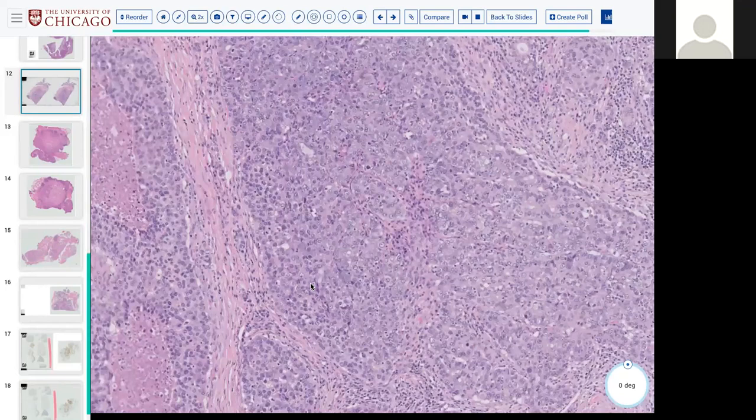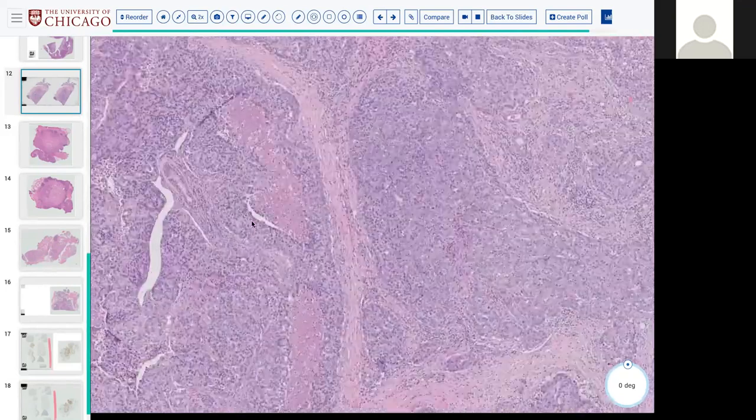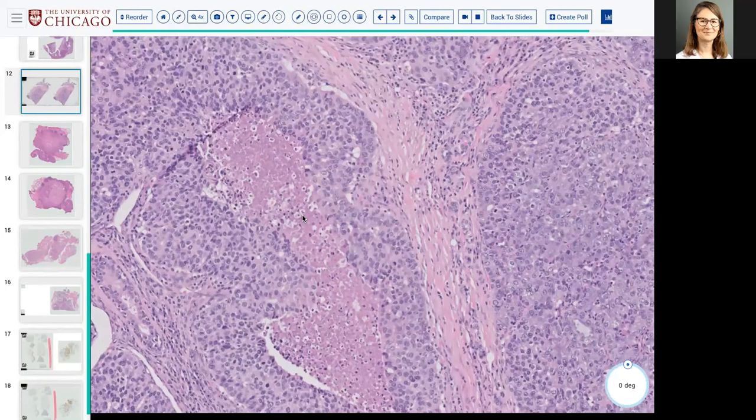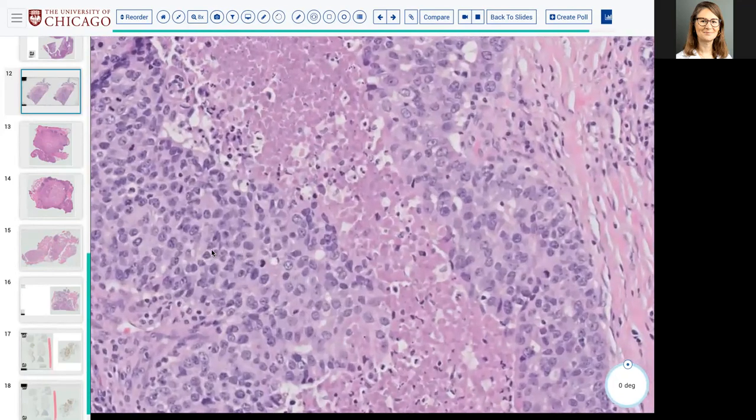Recall the high power features are very, very helpful here. If this is the one I'm thinking... Oh wait, no, this is not the one I'm thinking of. Never mind. I think I rearranged one or two of the slides from the preview, but yeah.